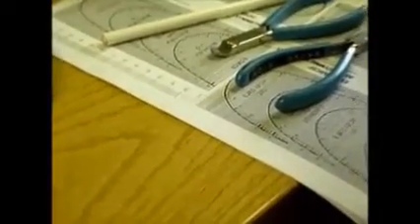So there's a relatively flat wire, and what normally happens is that you want to be able to hold the front end down on the table and have these bits flat on the table at the back, if you see what I mean? Yep. And if you look across the wire from side to side, if you hold it in the middle and look across, you want to be able to see one side hiding behind the other, and that should mean that you're pretty well flat again.